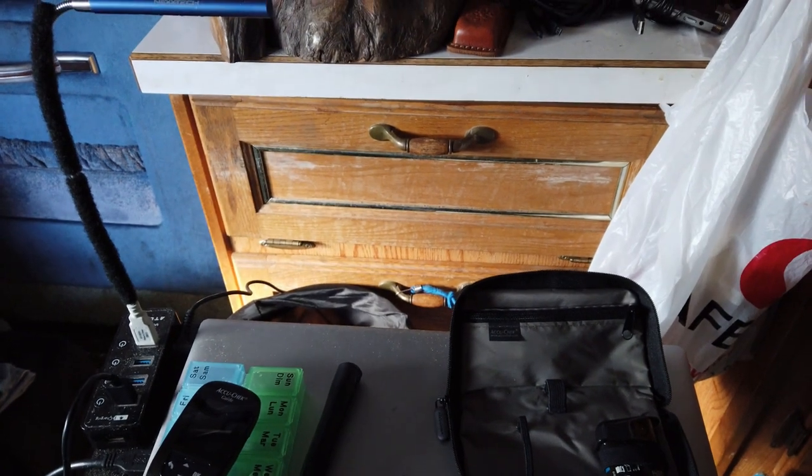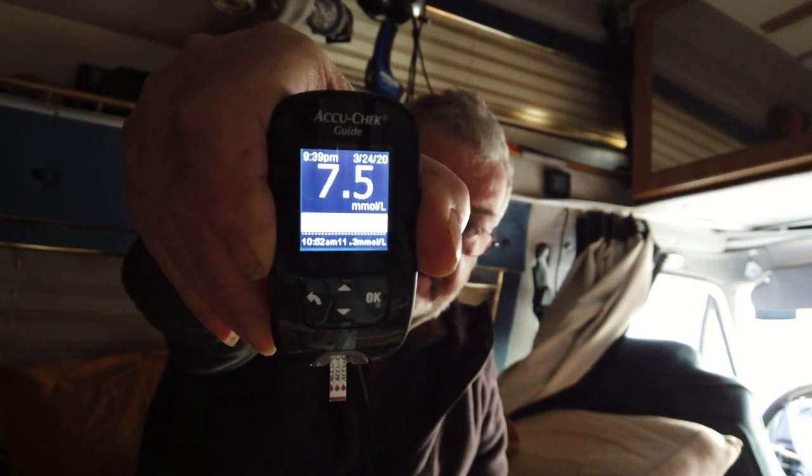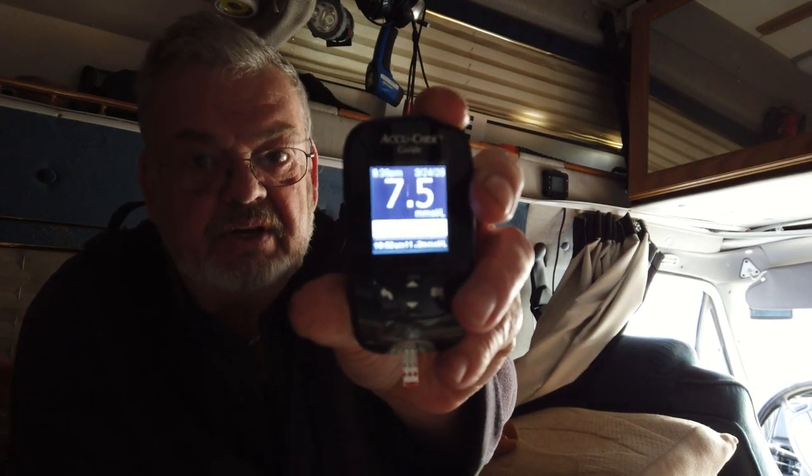Let's do a reading first thing this morning — it's 9:30, before breakfast. Okay, let's get a strip. Ouch, we prick the old finger. Okay guys, we'll see what the reading is first thing in the morning; I haven't had anything yet. 7.5 — it's supposed to be between 5 and 7 in the morning for a non-diabetic. So for a diabetic to have 7.5, it's probably pretty good.